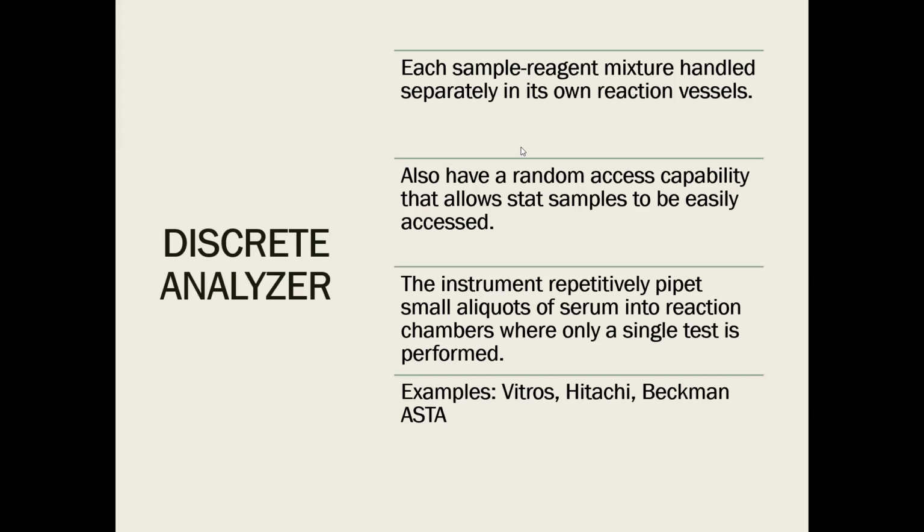Another thing is that each sample-reagent mixture is handled separately in a reaction vessel. Take note that discrete analyzers have random access capability that allows stat samples to be easily accessed. Lastly, the instrument repeatedly pipettes small aliquots of serum into a reaction chamber where only a single test is performed. Examples of discrete analyzers are Vitros, Hitachi, Beckman, and Astra.